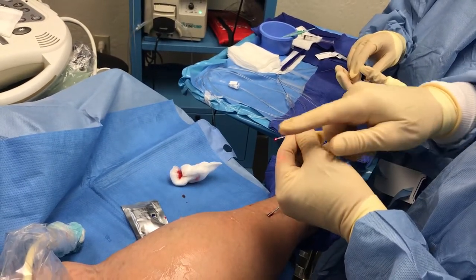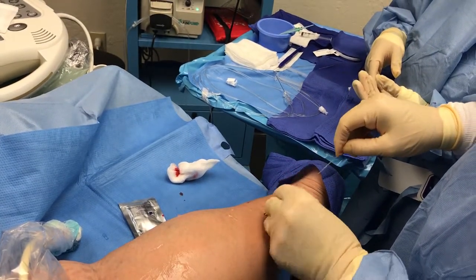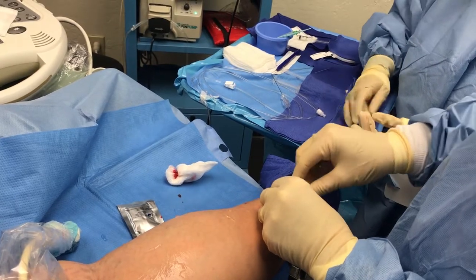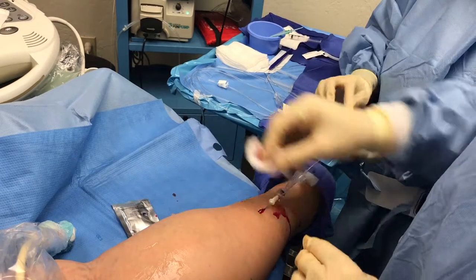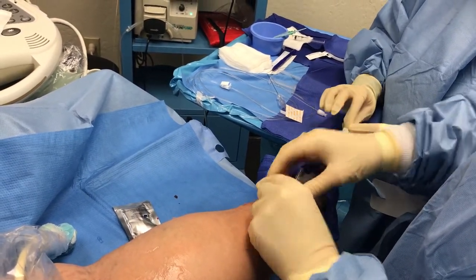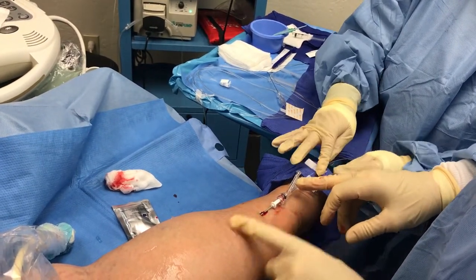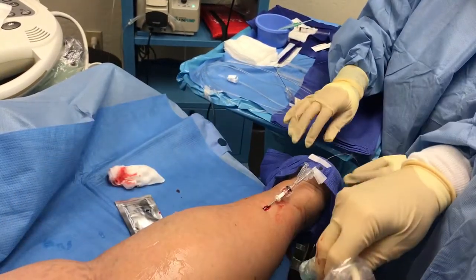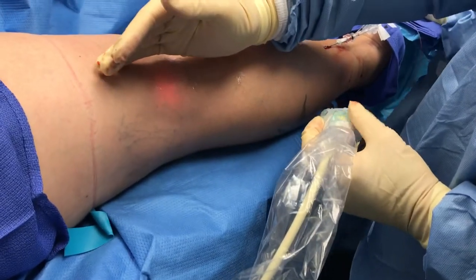This part goes to a thousand degrees centigrade; this part stays cold. You can see blood is appearing up here, which is a good sign. The slide's up and I'll just engage this little lock. It's important to make that little lock pretty tight, because I have pulled on this and left the catheter behind on one or two occasions.